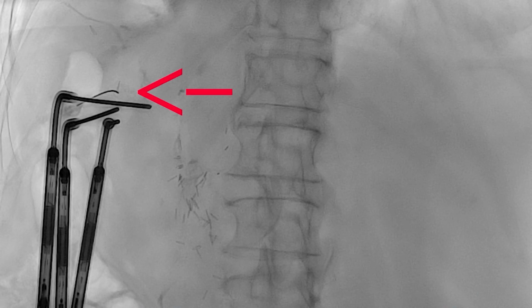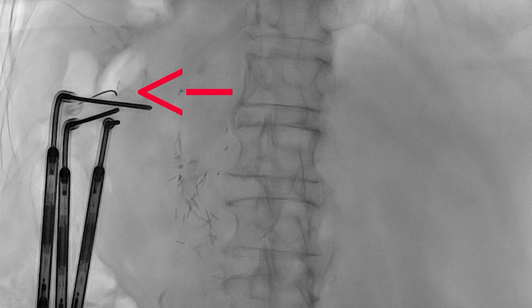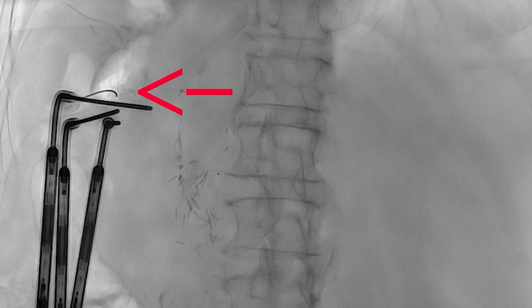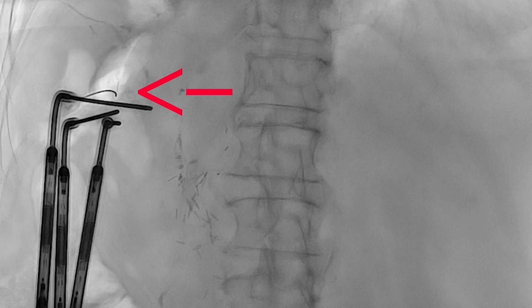The amount of displacement of the organs is checked with fluoroscopy, and usually no more than 100 cc's of gas is necessary to provide proper insulation.